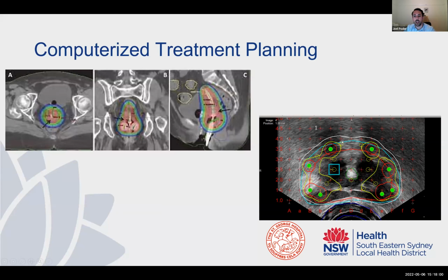Similarly, here for prostate, here's an ultrasound image of the prostate taken transrectally. We have some iodine-125 seeds in this case that were planned to be placed in different positions around the prostate. We have quite nice definition of the prostate on the ultrasound image. We have not quite nice definition down here of the anterior rectal wall. We have a urethra going through the middle.